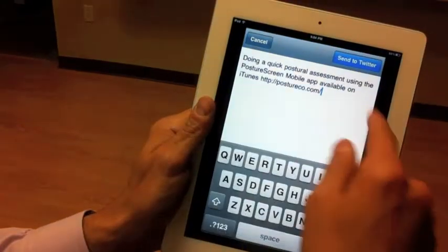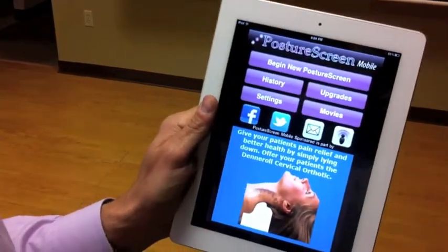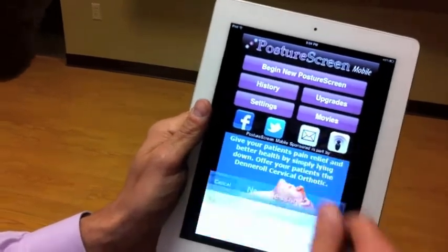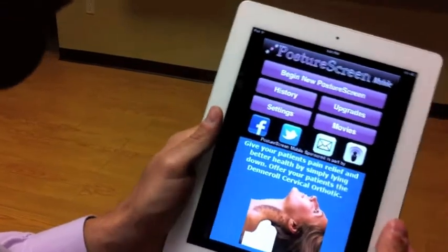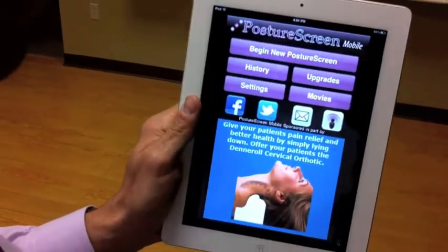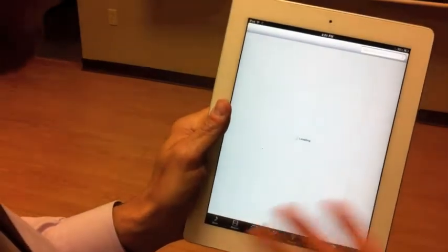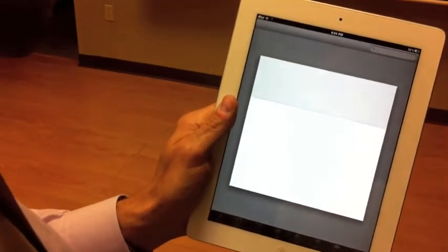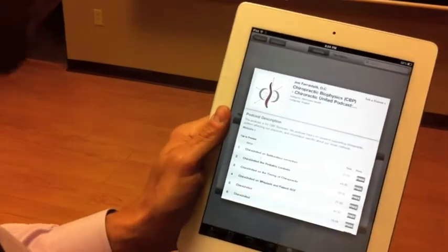Same thing goes with Twitter. We can go ahead and send a message to Twitter so that way you can have your followers find you when you're doing a spinal screening. We can email the same thing out, as well as if you want to learn more about Chiropractic Biophysics and Chiropractic United, you would hit this icon. It's going to pull up iTunes where you can find out the latest on CBP technique and Chiro United.